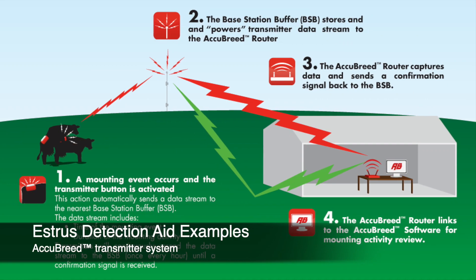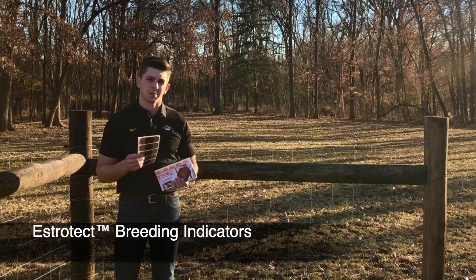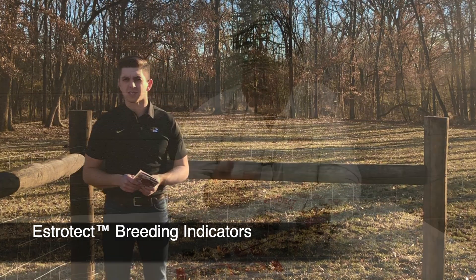There are also electronic systems like Heat Watch, AccuBreed, and Flashmate. I'm just going to focus in on Estrotect patches because I think these are really intuitive, and I've used these on about 20,000 animals with really good success.